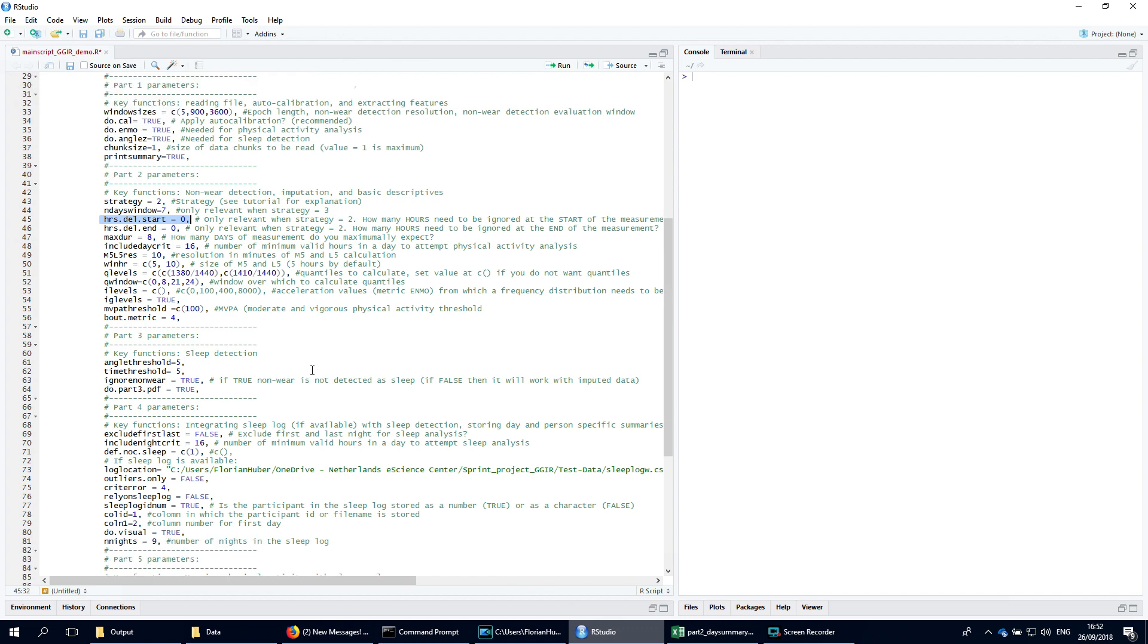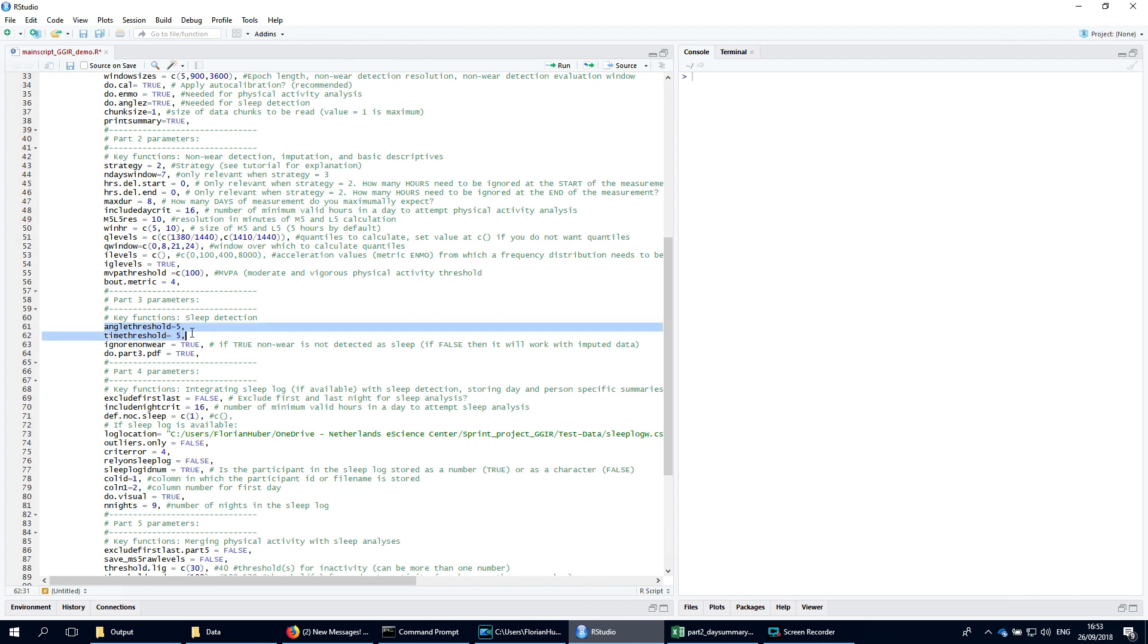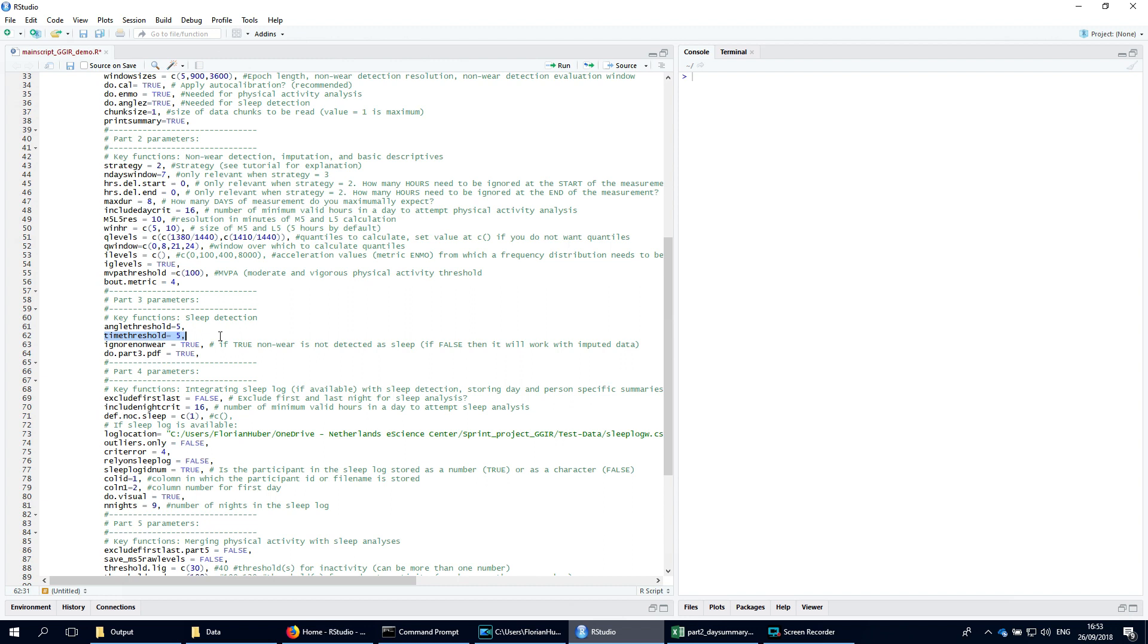Part 3 is primarily a preprocessing step for the sleep analysis in part 4. Here the code detects time segments during which the accelerometer did not rotate beyond a certain number of degrees for a certain minimal duration, which you specify with these two arguments - one for the angle and one for the minimum duration in minutes. The default is set to 5 for both, which is based on current evidence the best choice.